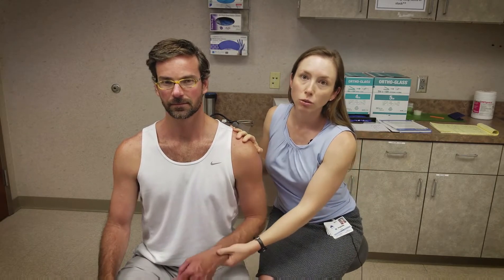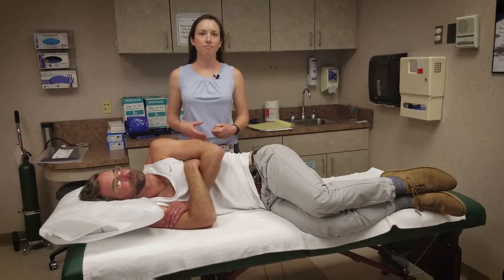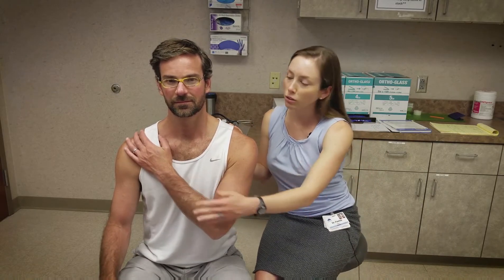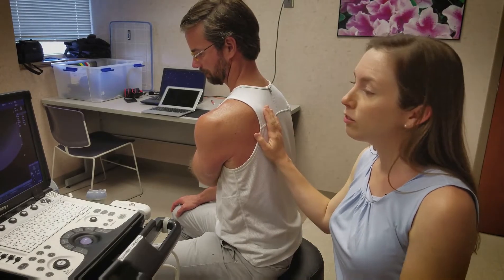There are two ways to position the patient: sitting in the upright position so that the provider can manipulate the shoulder joint, or lying in the lateral decubitus position if you're concerned about your patient fainting. The patient's ipsilateral hand will rest on the contralateral shoulder. The provider will be behind the patient with a clear view of the ultrasound.